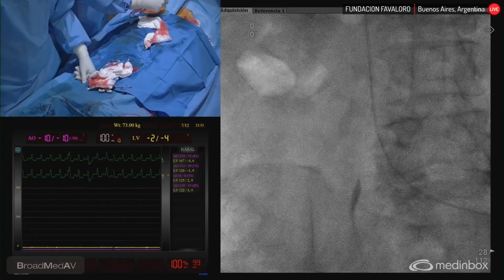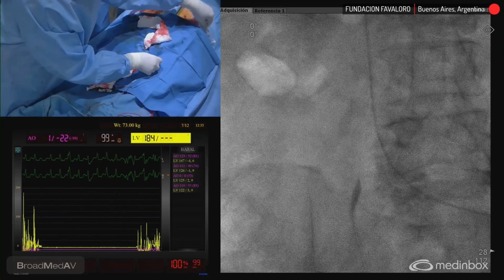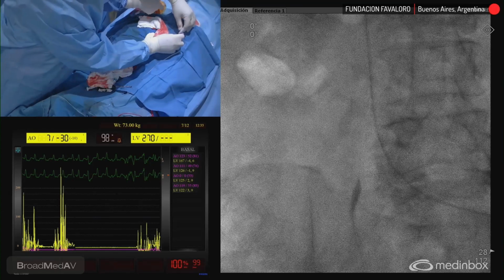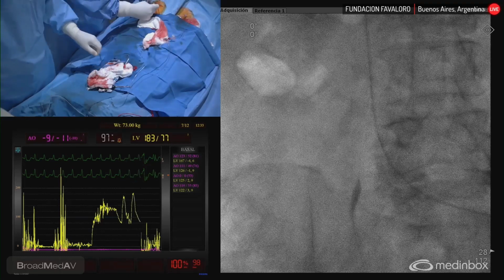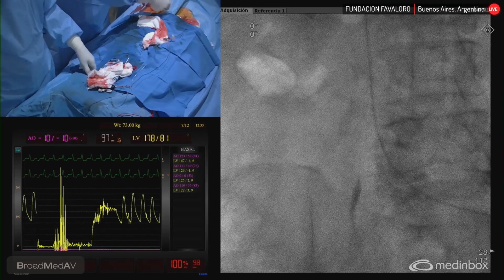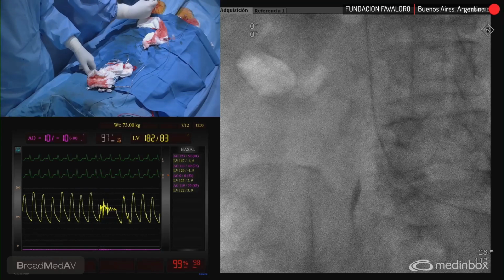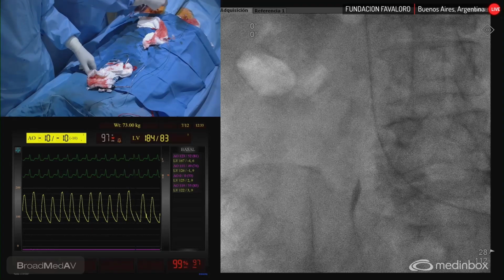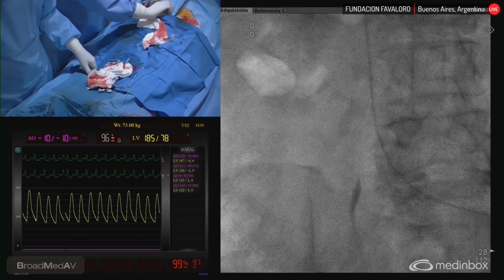So, Kenya, any additional findings, any comments? I measured again the intraventricular gradient, with color Doppler and also with the spectrum, and we can see that it decreased significantly. The intraventricular gradient is 8, and the mean gradient of the transaortic valve is 7, and there's no pericardial effusion.